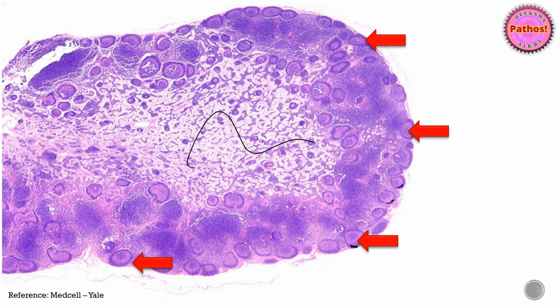And if you focus a little more on the germinal center, you'll be able to see that there are darker areas and lighter areas, which tells us that these are normally proliferating or normal secondary follicles. This bluish merging area between the two is the paracortex, and here this is the medulla. So that's your basic identification of the different parts of the lymph node structure.